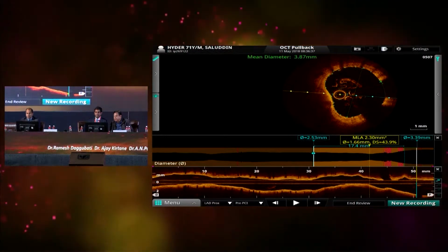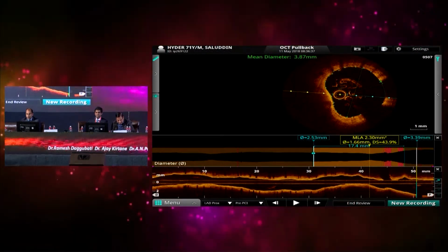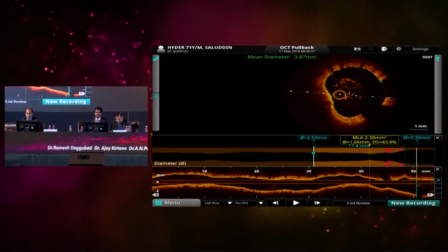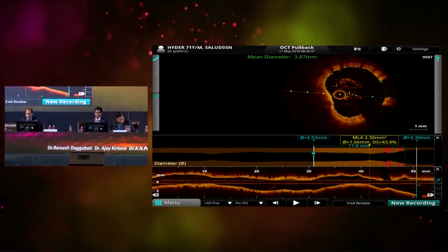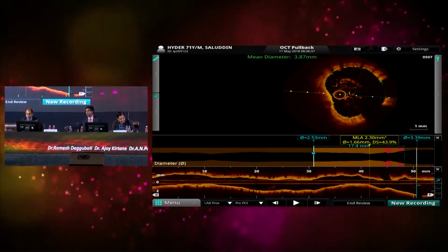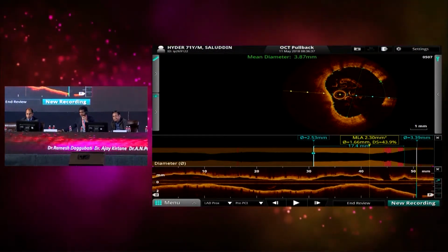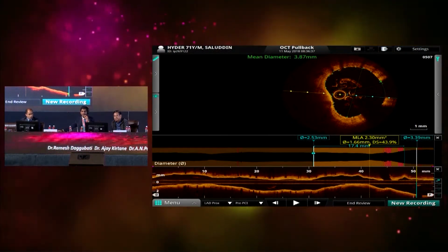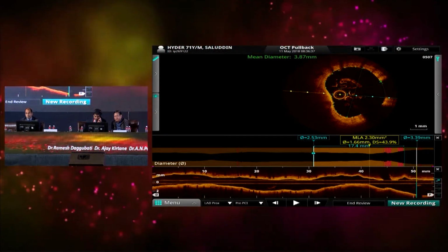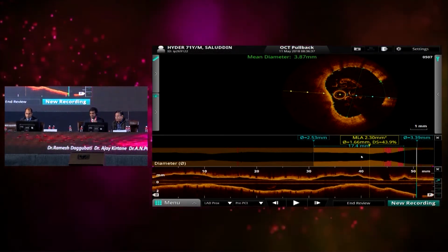Well, I'm very hesitant to put any stent less than 4.0 inside a left main. The proximal LAD in a typical male, irrespective of demographics, is going to be at least 3.5, so I don't believe that 2.5 measurement in the proximal LAD. What we do is take a 3.5 stent and then dilate with a 4 millimeter balloon near the left main, then do the OCT and check. I would take a 3.5 and probably post-dilate with a 4.5.